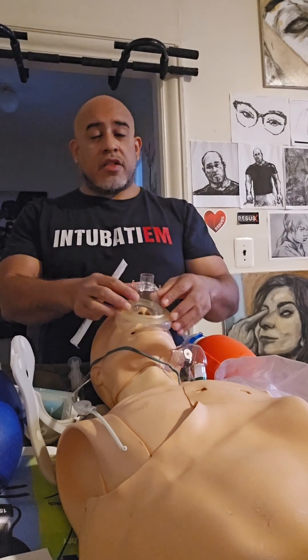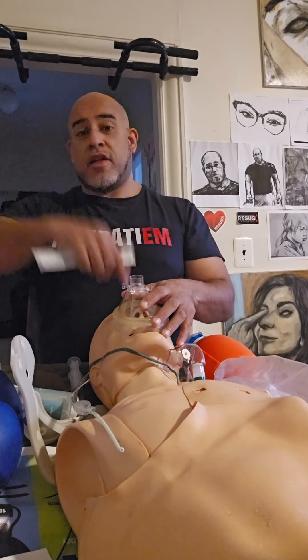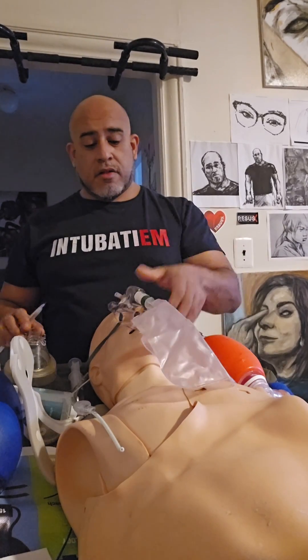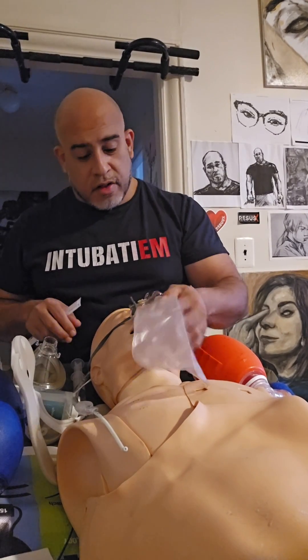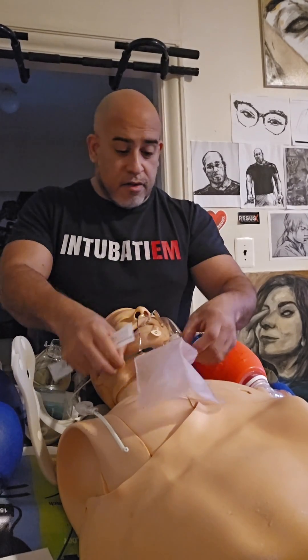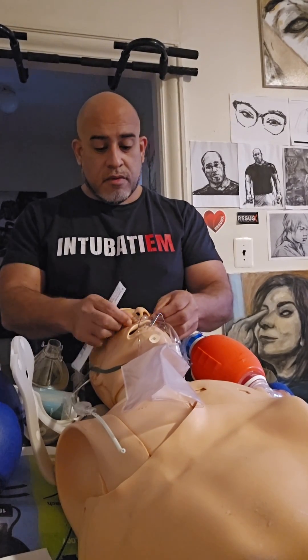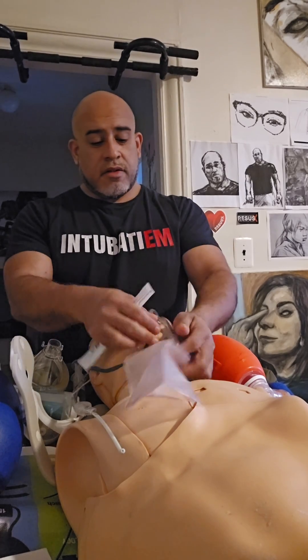Pre-oxygenation connected to a circuit that's continuously delivering oxygen to the face is very different from just a face mask. Because of that, we have to do things a little differently — like running this at 15 liters or more.